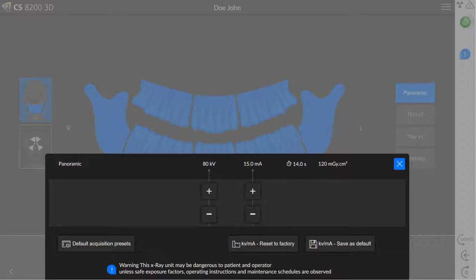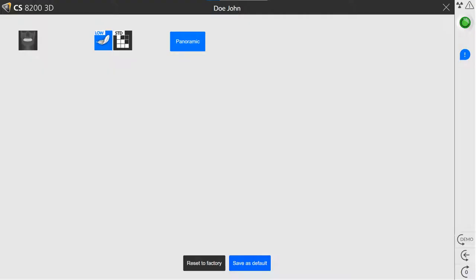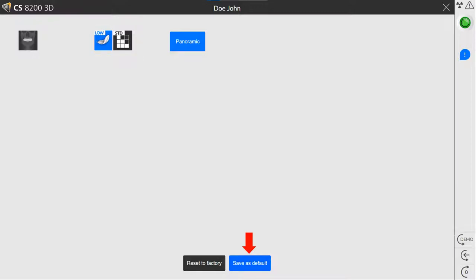If you want to set these values as the default parameters for the patient type you have selected, click KV and MA, save as default. Until these settings are changed, the selected patient type uses the KV and MA value you have selected. To reset the KV and MA back to the factory settings, click Reset to Factory. Click Default Acquisition Presets to set the imaging mode to start in Standard Dose or Low Dose mode for full panoramic exams. Click Save as default. To reset the default acquisition presets back to the factory settings, click Reset to Factory.